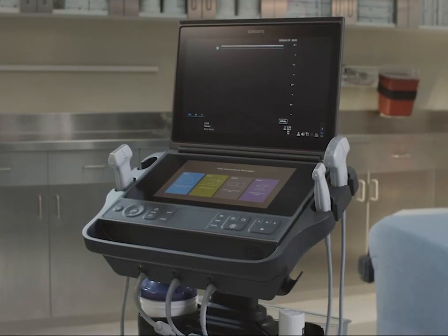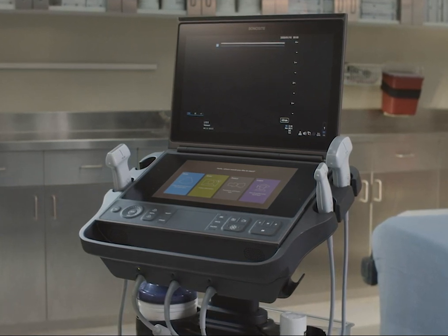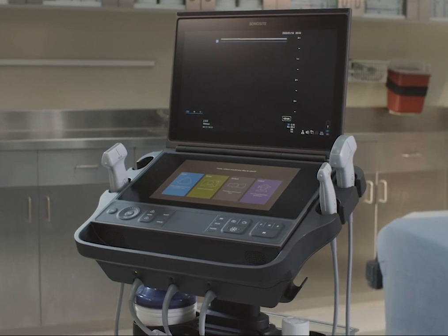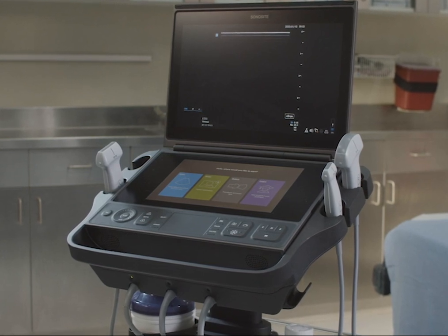We will first show you how to clean and disinfect the system. Then we'll clean and disinfect a transducer when the skin is unbroken and there is no blood or other bodily fluids. Then we'll show you the additional steps you need to take when blood and other bodily fluids are present.